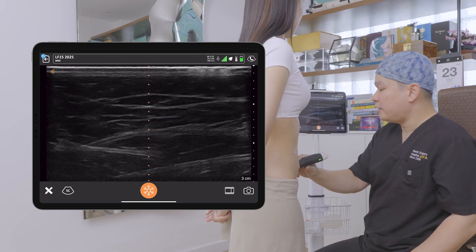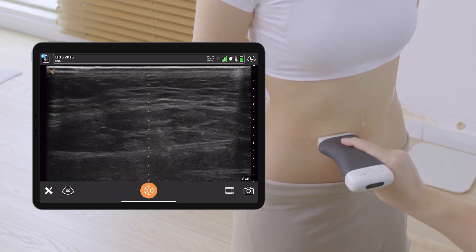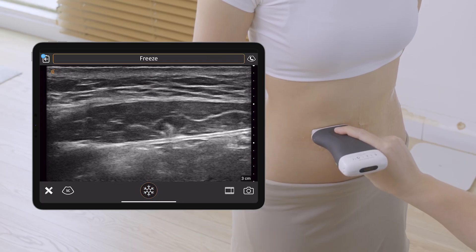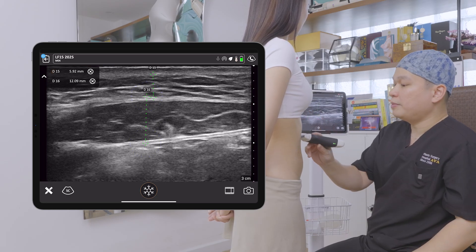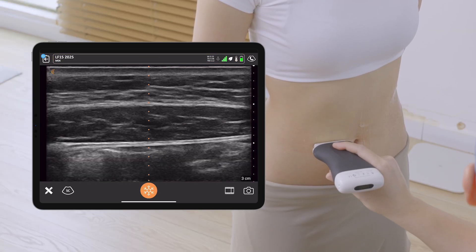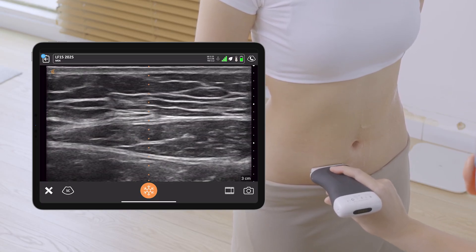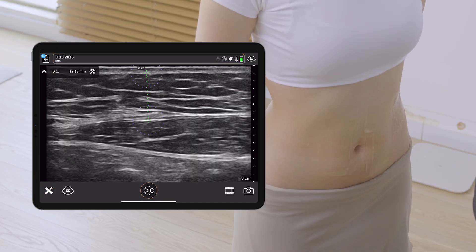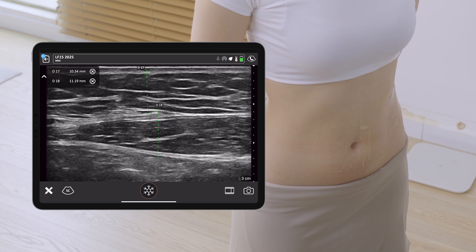I complete my scan on the left side, then repeat the scan for the right side. Again at around 3cm above the umbilicus on the right side, I freeze and do my measurement — about the same as the other side. Then we go down below the umbilicus around 3cm and on the right side I do the measurement again. The fat and rectus muscle thickness is very uniformly distributed.